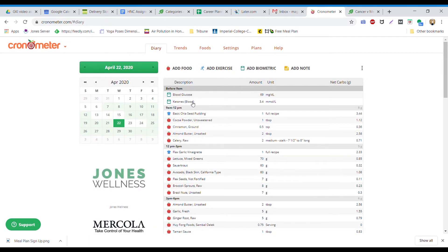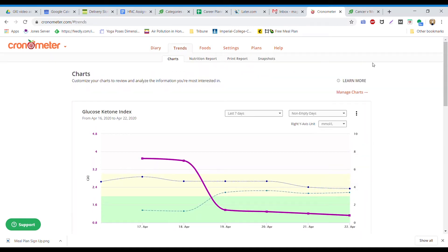Once you see those entered into your diary, they're also now being tracked in the trends. You can set up this chart to monitor your glucose ketone index, which is the dark line, your ketones, and your glucose. Our goal is to stay under one as ideal. Anywhere in the green zone under two is amazing. Under the yellow is still therapeutic ketosis. Super handy for tracking.